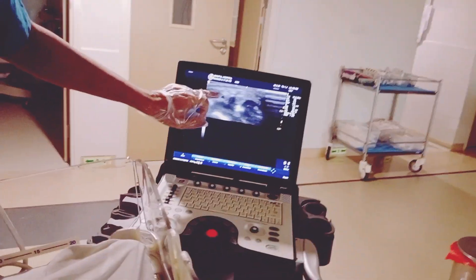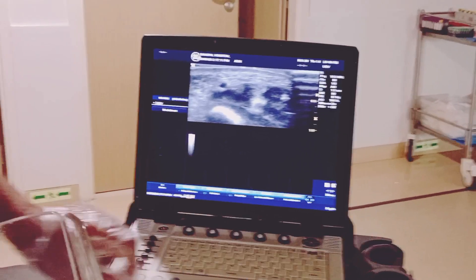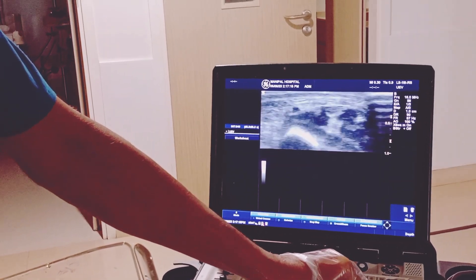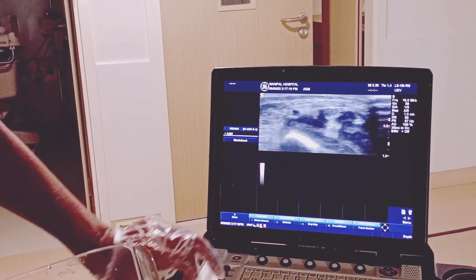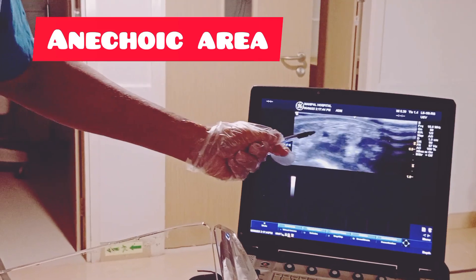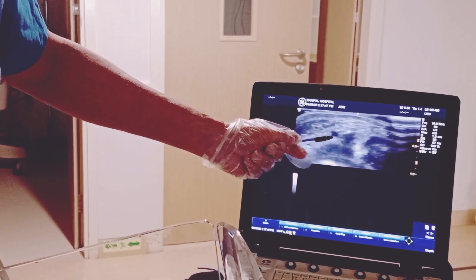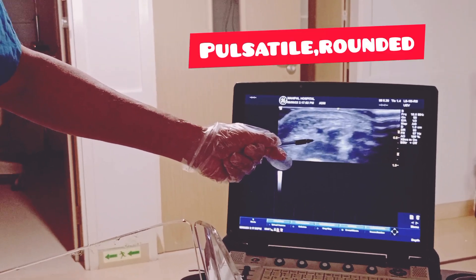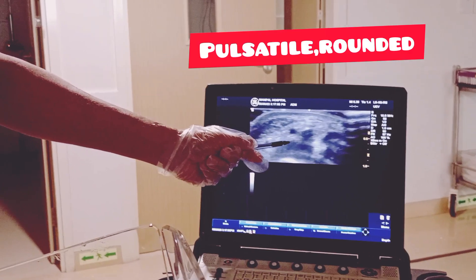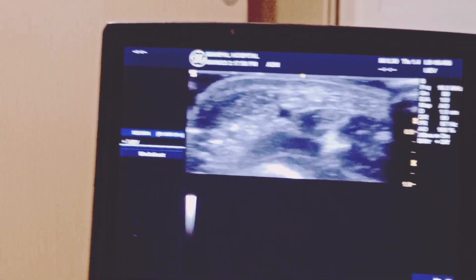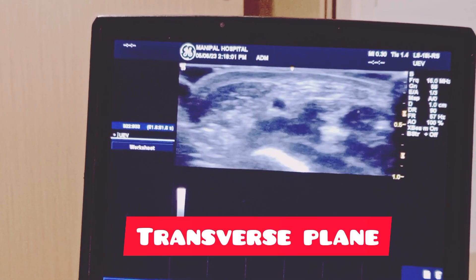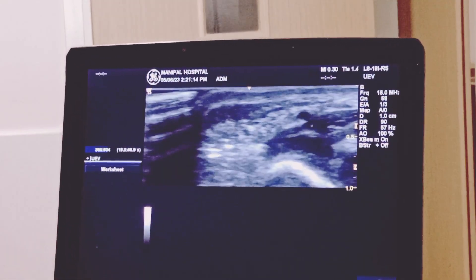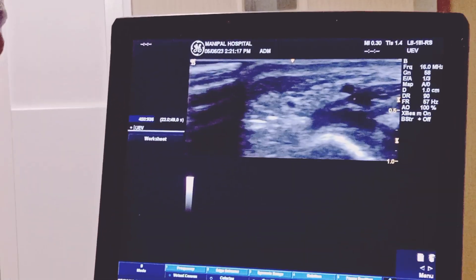You can see it is rounded and pulsatile — an anechoic area bound by a hyperechoic rim. You can see this is the area — anechoic and pulsatile, usually rounded. This is the radial artery on the transverse plane. With color Doppler applied, you can see the color — it is rounded and anechoic, bounded by the hyperechoic area. This is the radial artery on the transverse plane.